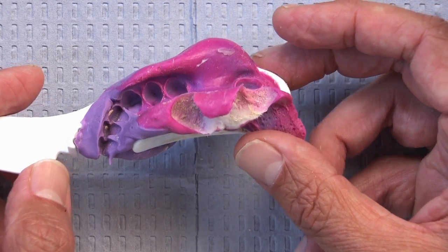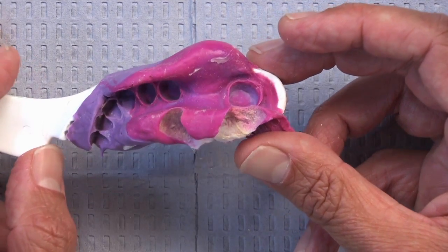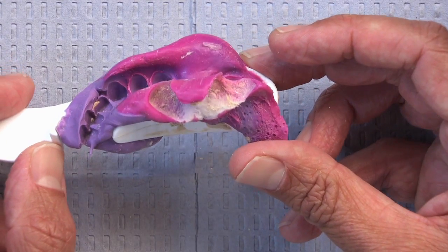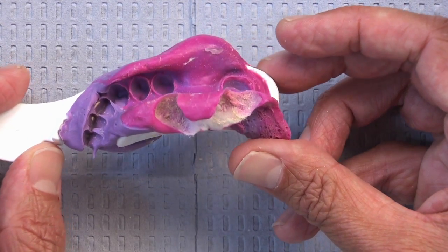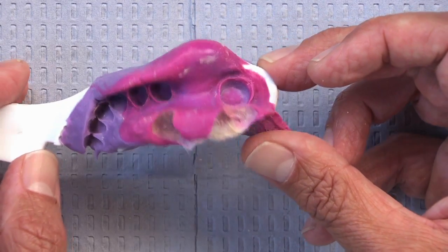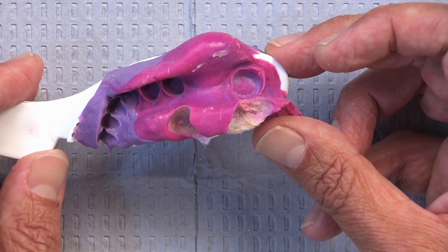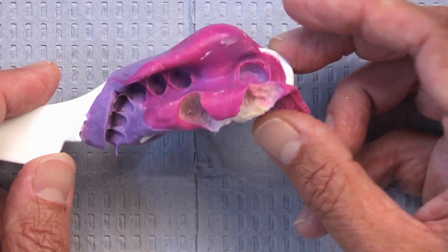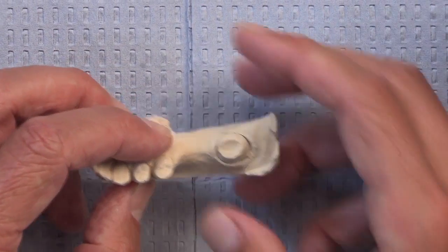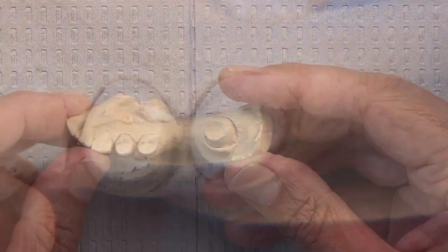There's times where I cut the doctor slack because I wasn't there and it might have been a hard prep, but in a case like this, I get a little more hard-edged about it and say, you know what, you really got to do this in a metal full arch tray to give us the best chance of getting a good result. So let's go ahead and take a look at what we poured up and see what we can see.